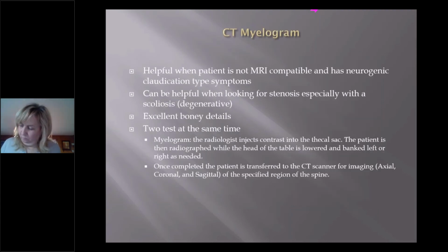CT myelogram, not very commonly utilized outside of specialties. This is rarely utilized by primary care. I'm just going to touch on it briefly. You know, we were talking earlier, if you've got a patient that's got a suspected herniated disc, but they have a pacemaker, and we just said CAT scan is a terrible test for soft tissue, well, then how the hell are you supposed to figure out what's going on? There's a test called a CT myelogram, and CT myelogram is a test where the radiologist injects a contrast dye into the intrathecal space, into the back, and it can be done to look at the lumbar, thoracic, or cervical area.